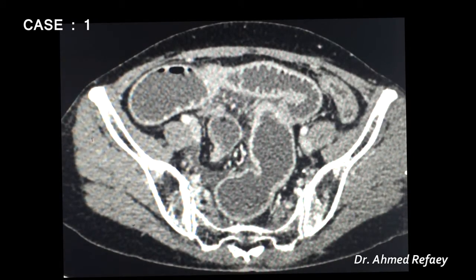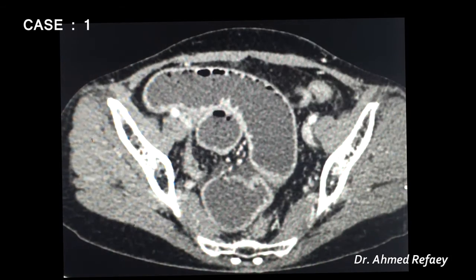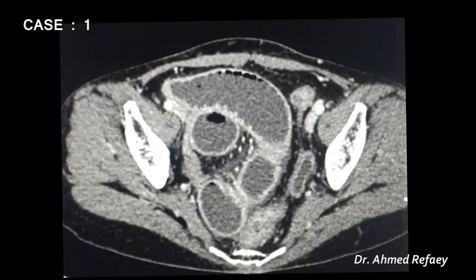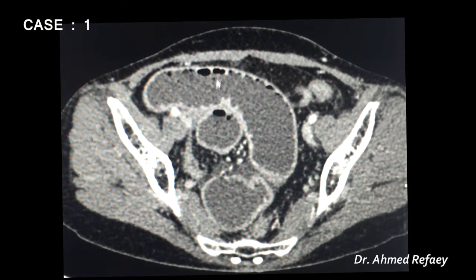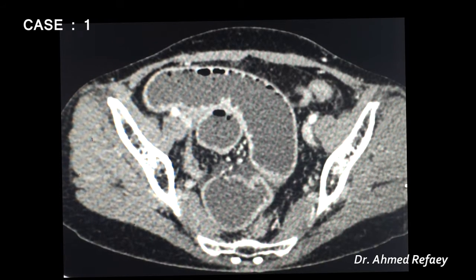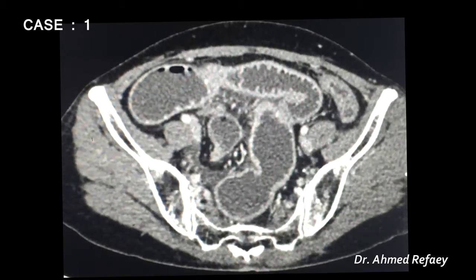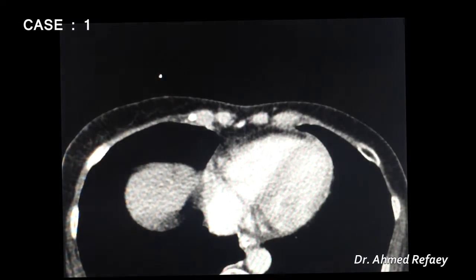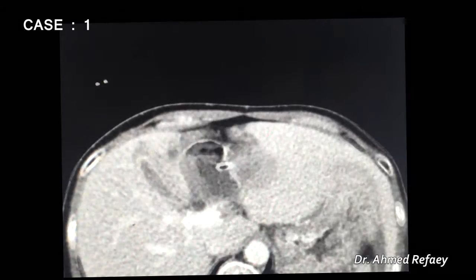The next step is to assess for complications, particularly ischemia and pneumoperitoneum. The small bowel wall shows normal enhancement and no thickening, with no evidence of non-enhancement to suggest ischemic changes. There is also no pneumoperitoneum.